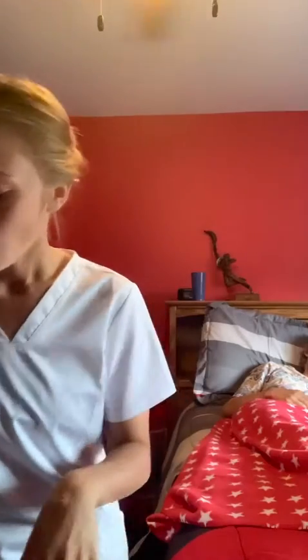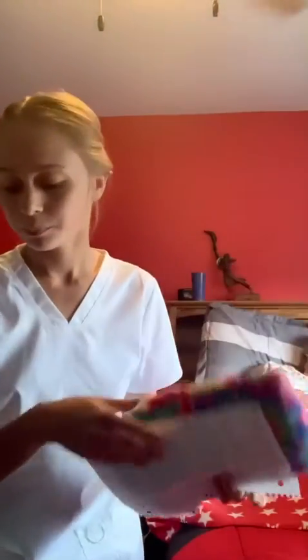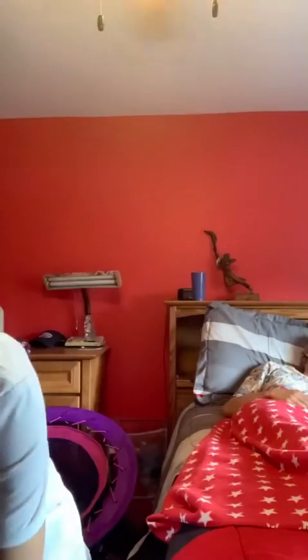Then you are to gather all of your supplies. So the supplies that I am going to be needing are a seat cushion, a paper, non-skid footwear, a robe, and a transfer belt. So after I have gathered all my supplies, I'm just going to wash my hands again.